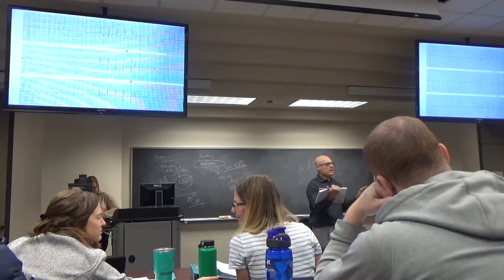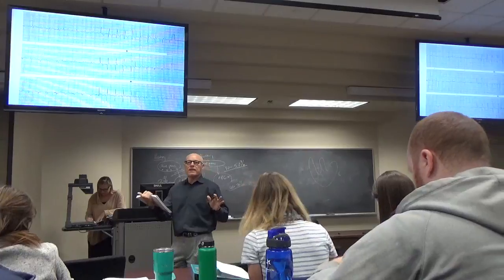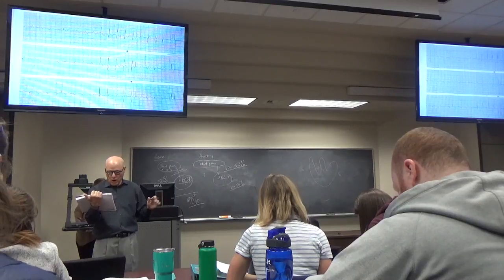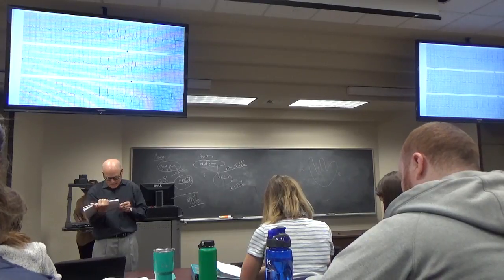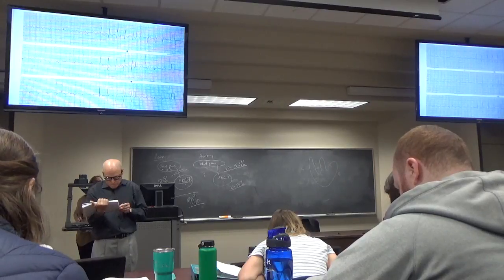Okay, so this is sinus tachycardia, and this is left axis deviation. Is there a bundle branch block? No. What's the QRS? V1, V2, V3. I think there's a bundle branch block. Right bundle branch block.